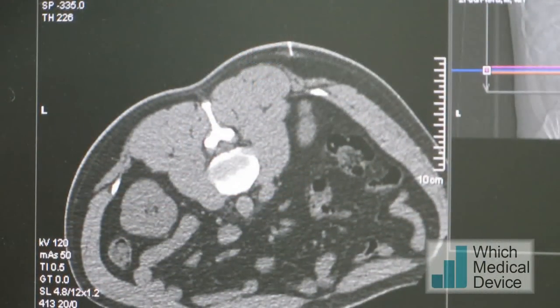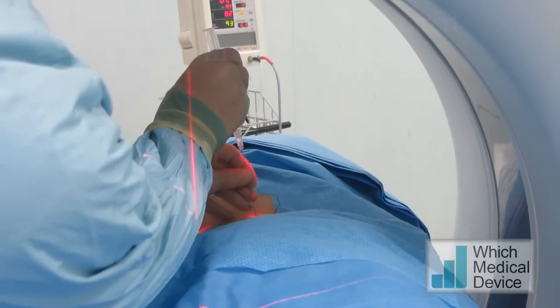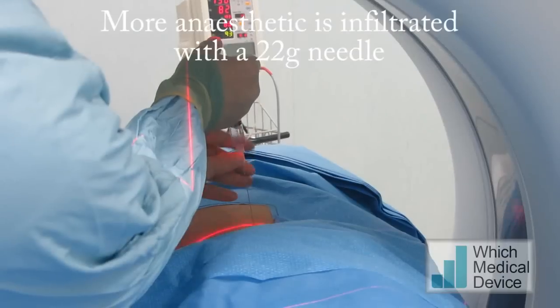We're just going to put some more local anaesthetic in now, using a slightly longer needle, aiming along the same trajectory that we're going to be doing our ablation along.